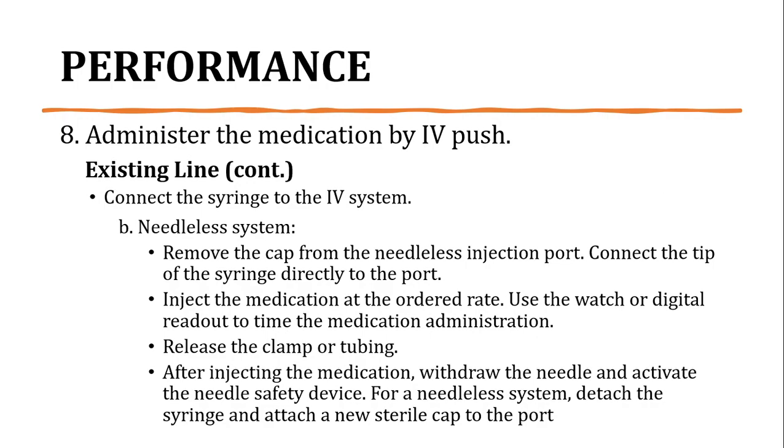Then second is the injection. Inject the medication at the ordered rate. Use the watch or digital readout to time the medication administration. Release the clamp or tubing.